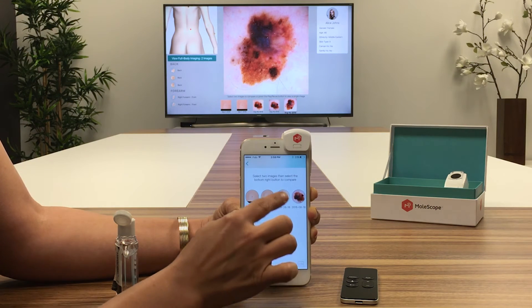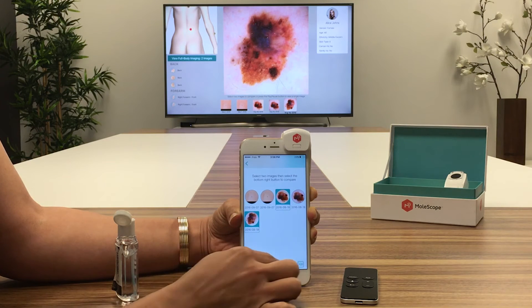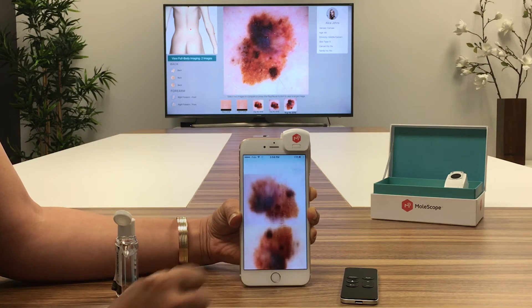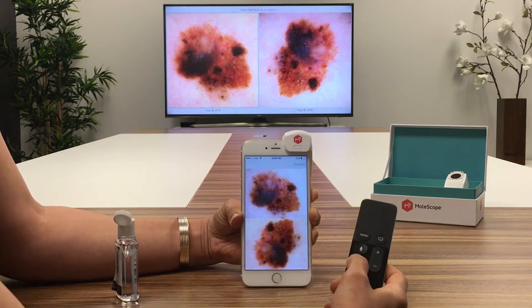Side-by-side comparisons are made directly through the TV, providing a high quality, detailed view of the lesion for your patients.